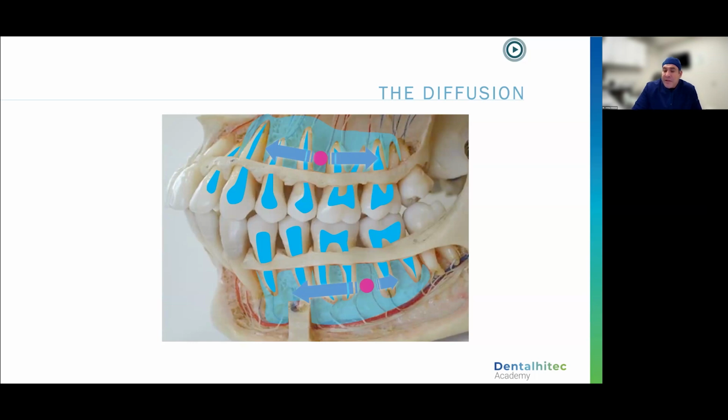Now, the thing we need to remember is this is not always the case with our primary dentition. With that 9mm needle, you will likely be able to get at least 1 tooth distal and 2 teeth mesial on the lower. On the upper arch, at least 1 to 2 mesial and 1 to 2 distally.